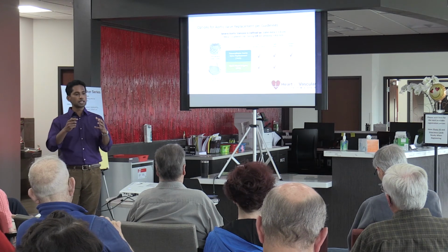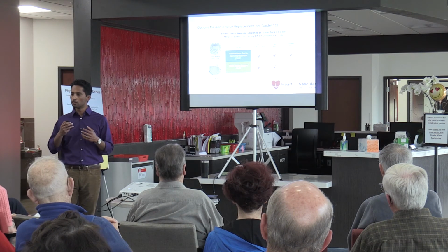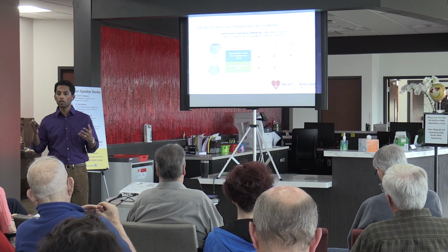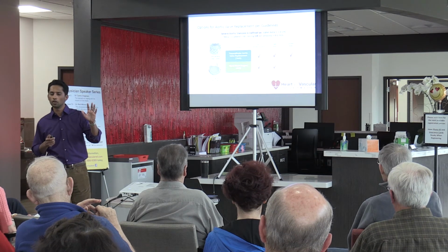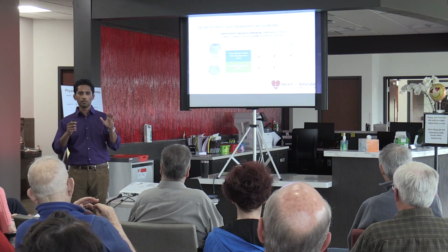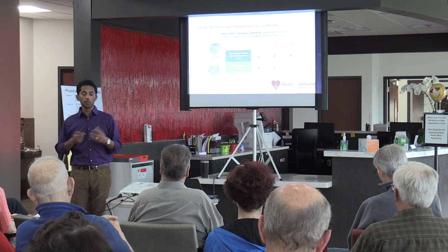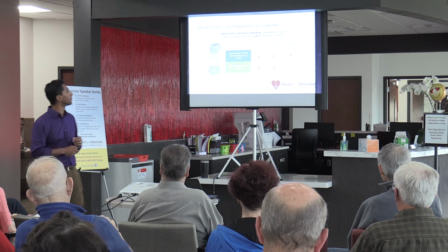But what that means is that moving forward, this minimally invasive way of trying to fix aortic stenosis is going to apply to the vast majority of patients. Whereas previously it was reserved for the very elderly, the very frail, the very sick, and fairly soon it's going to be available to the majority of patients that present with this problem, and then we'll have some kind of decisions to make as to what the best way is to treat.